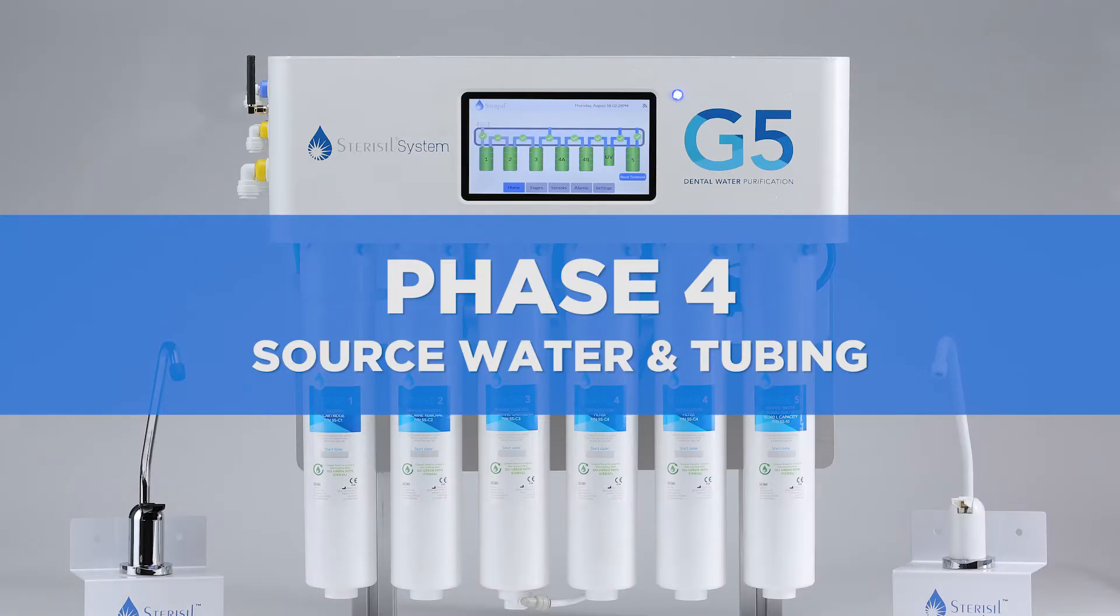Phase four, source water and tubing. In phase four, you'll be linking the peripheral components with tubing and preparing the municipal source line to supply the G5 with water.